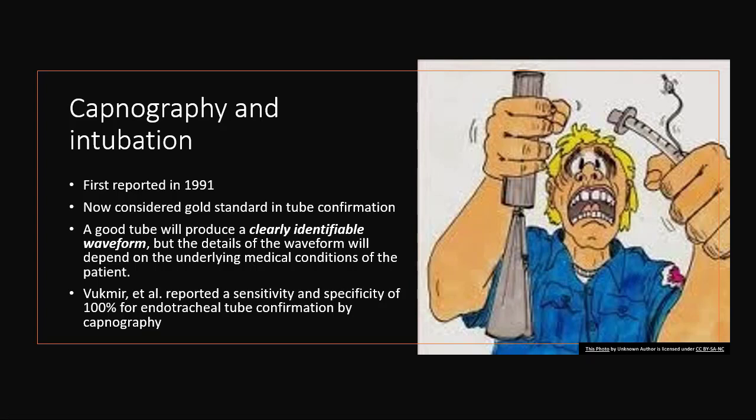If you have a gut tube, you go to court, and you don't have end-tidal CO2, you're screwed. Bottom line. If you go before your medical director and you don't have a good end-tidal CO2 waveform to prove that tube is in place, you're screwed. If that tube gets dislodged on transfer over to the ER bed and they put on end-tidal CO2 to confirm placement, they will have a waveform they can point to. If you don't have one immediately before, it's on you.